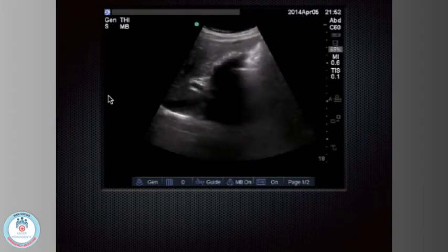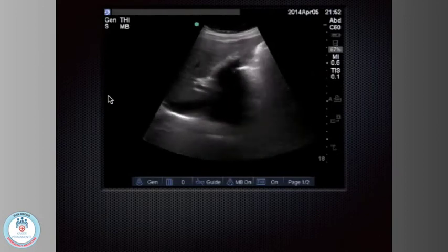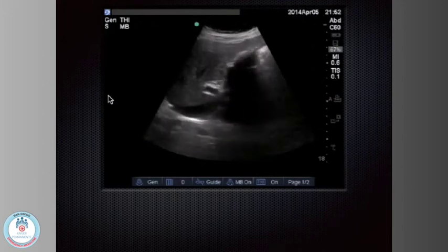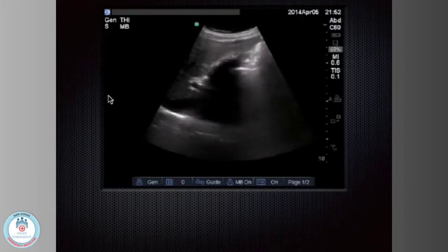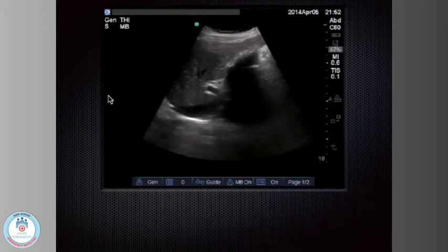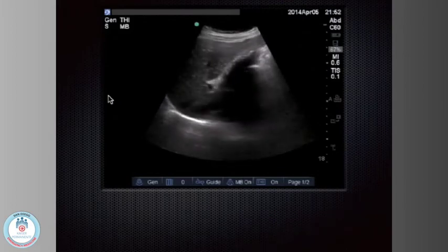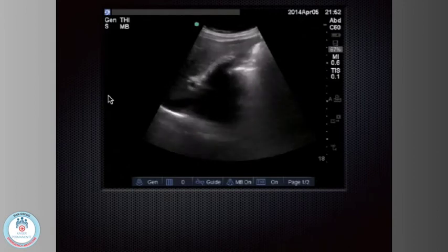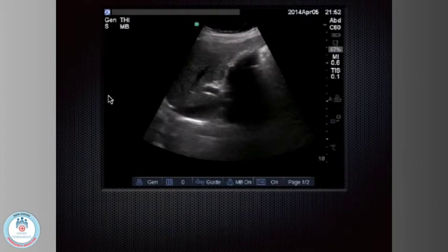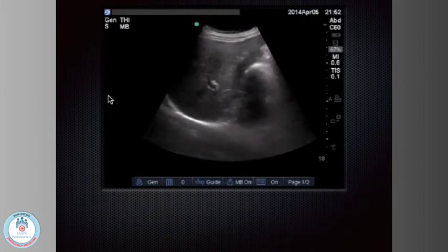How about this? So ultrasound for gallstones remains a conundrum. If you ask my senior residents what's the hardest thing you do with ultrasound, they'll say it's definitely the gallbladder that still gives them a run for their money. They come find me and say, I can't find the gallbladder. I walk in the room, turn the lights on, and I check for scars right away. Nothing more embarrassing than pointing out something and finding out later there is no gallbladder.